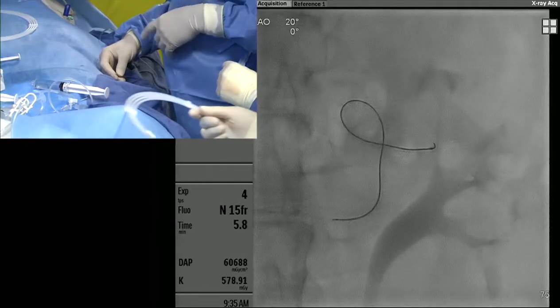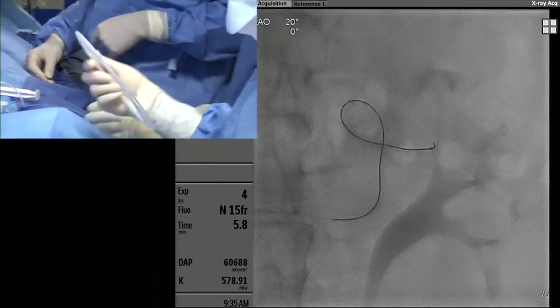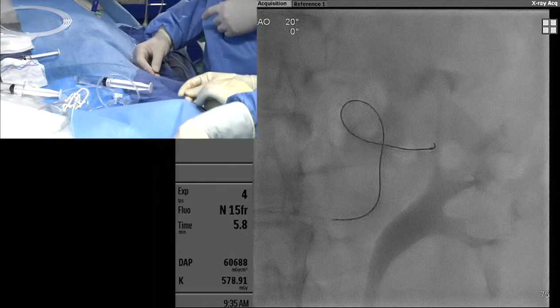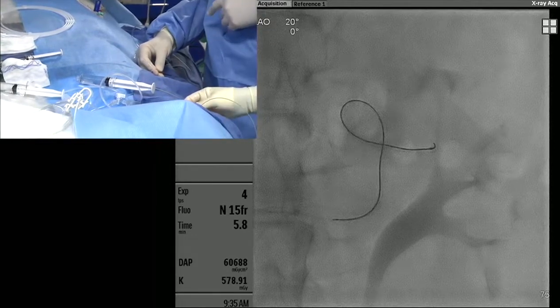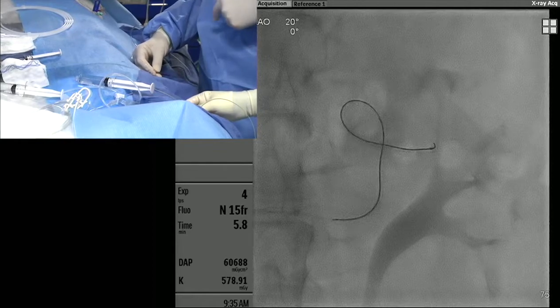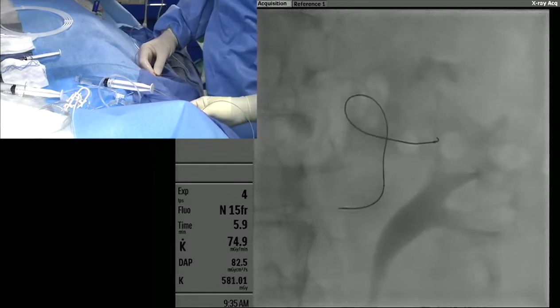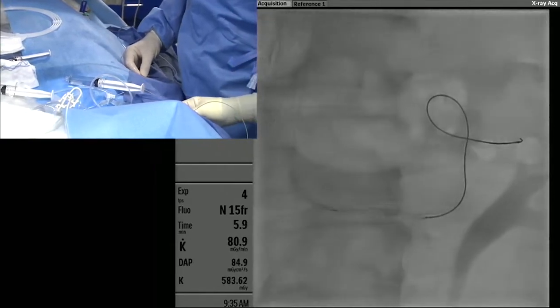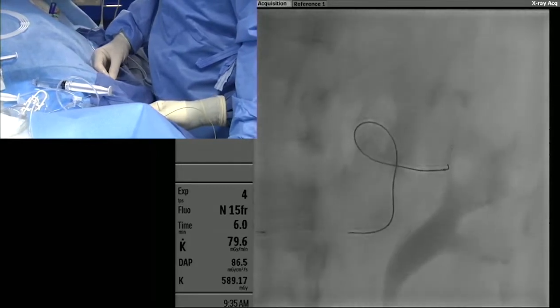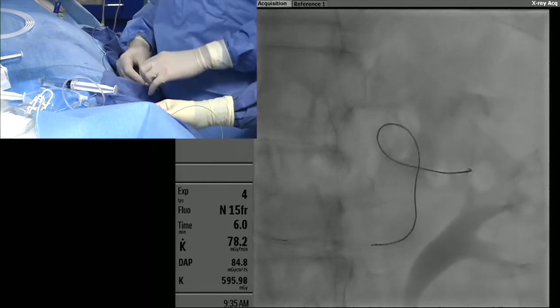I'll go through our setup quickly. We have a detachable coil ready to go. We have a 6-French slender sheath in the left radial artery, a 6-French Sherpa guide catheter seated very nicely in the left renal. Through that we have a 150 cm direction microcatheter and we're about to introduce an Interlock coil.